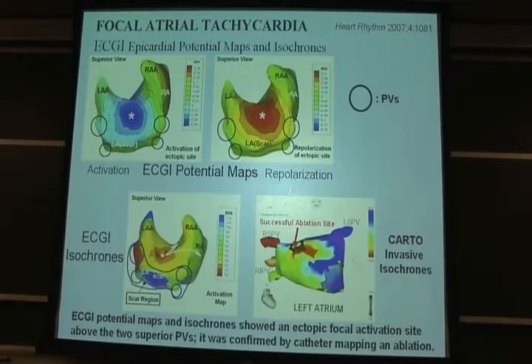And it was not clear where it was coming from, so we did this non-invasive image, and what we saw was an intense minimum right here on the roof of the atria between all the pulmonary veins. See, there is a very strong minimum. You can think about why a minimum.